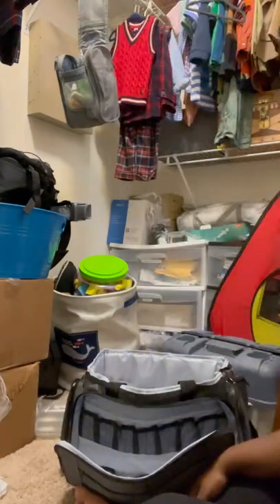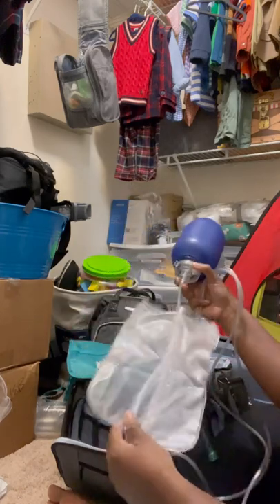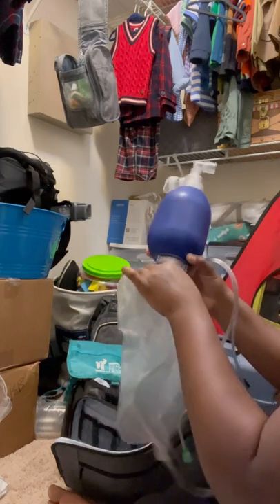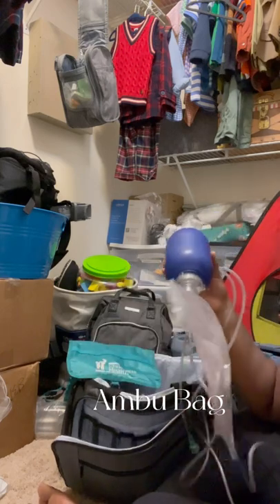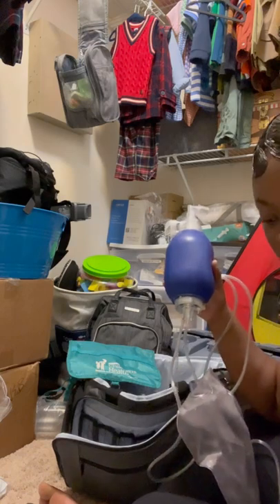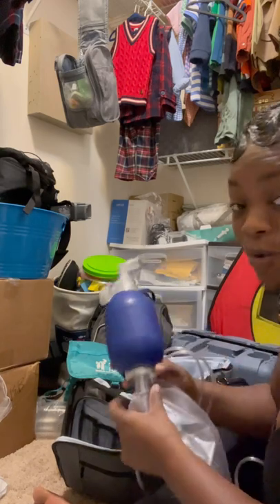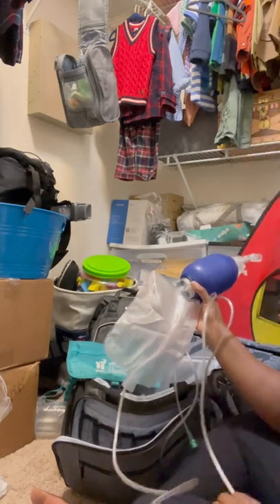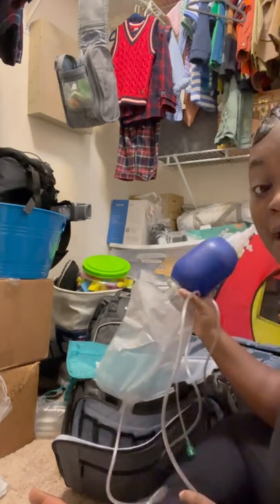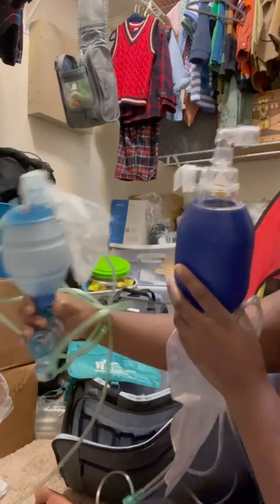This is what you call an ambu bag — I keep this in the car but I got it to show you what it looks like. There should be one in the car and one in the house. We have one in the car and two in the house. I love having an extra one because there has been a time where the ambu bag did not work and I was bagging Braylon and had to do CPR mouth-to-trach. Even though the hospital tells you not to do it, doing mouth-to-trach basically saved Braylon's life. This is one style of ambu bag, and this is another style.